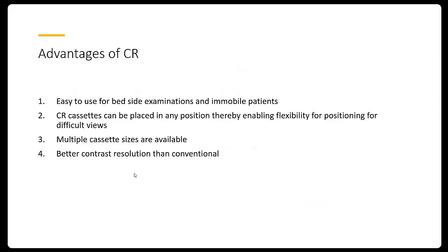Okay, and for immobile patients too. Then the CR cassette can be placed in any position, thereby enabling flexibility for positioning for difficult views. So with the help of a CR cassette, we are able to position for difficult views also. Then multiple cassette sizes are available, and there is a better contrast resolution than the conventional system.